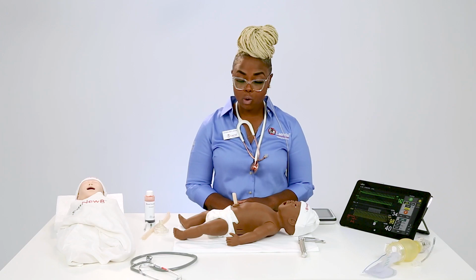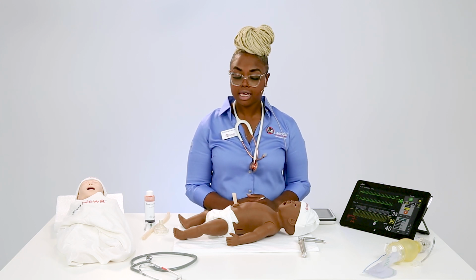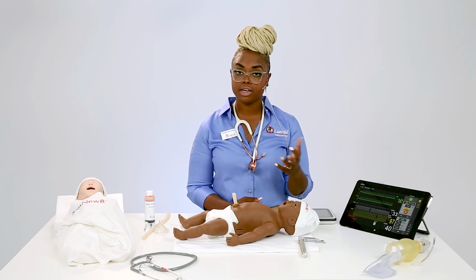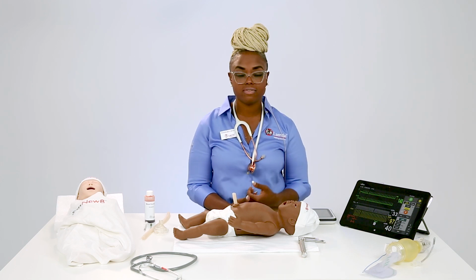Thanks, Rotera. Next question, does it have CPR feedback on Simpad? No, it does not, but it does recognize when CPR is started as well as when assisted ventilations are being provided. Another question we got was, does it have the ability to tell a learner if their rate and or depth of PPV and compressions is off? No, it does not, because that goes along with the components of QCPR, but it does recognize that you've started your CPR and you're off the chest, and it shows you when you stopped your CPR, as well as when you're giving ventilations.